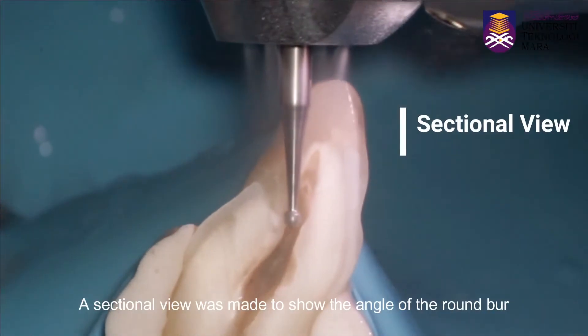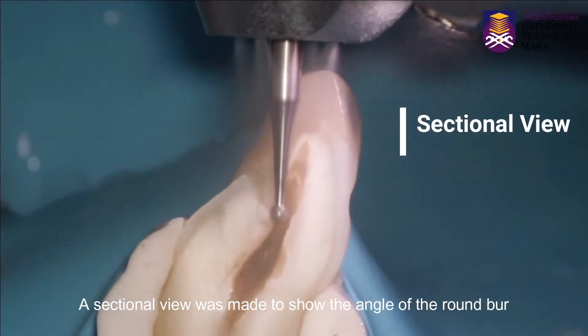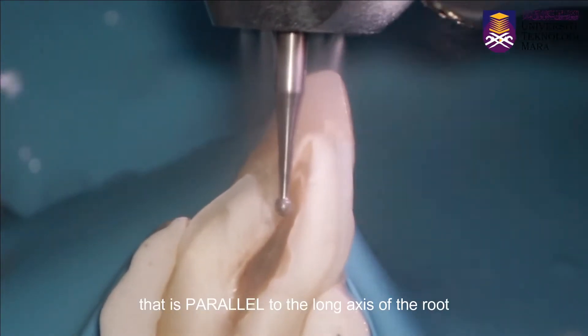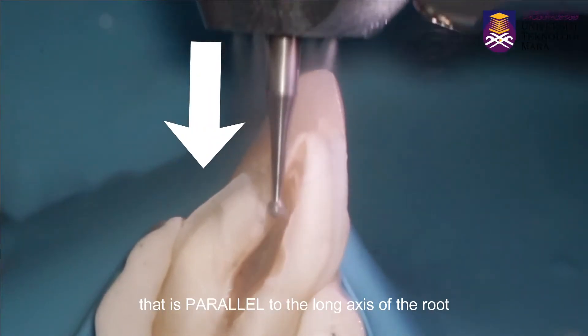A sectional view was made to show the angle of the round burr that is parallel to the long axis of the root.